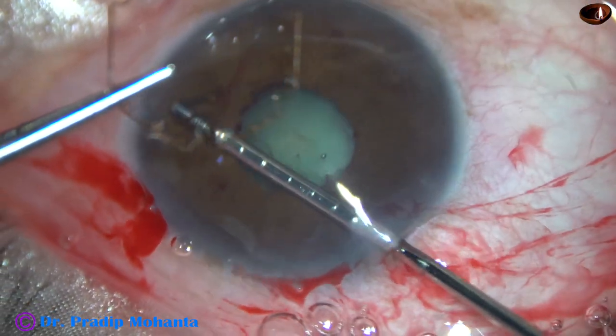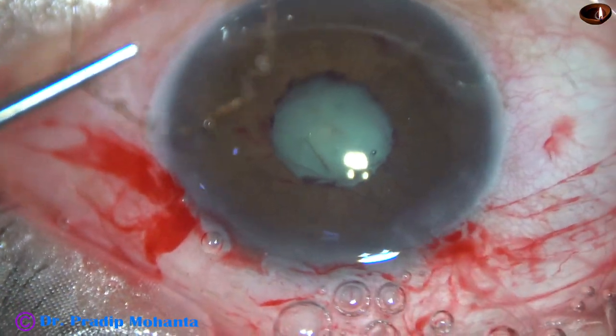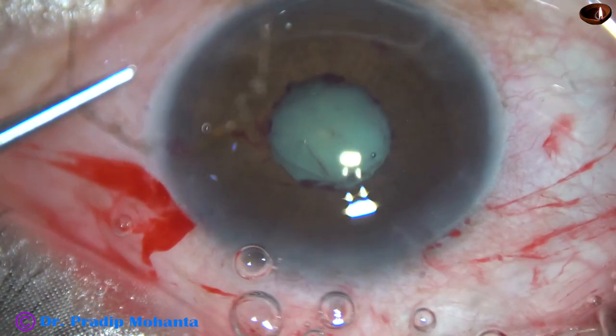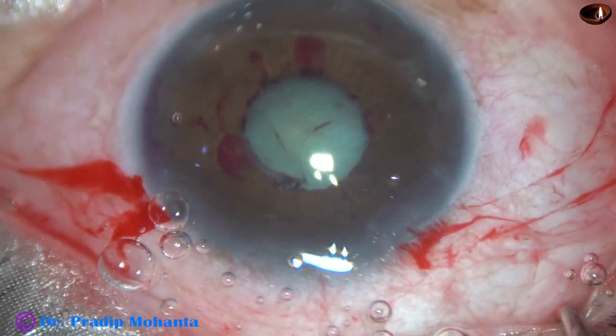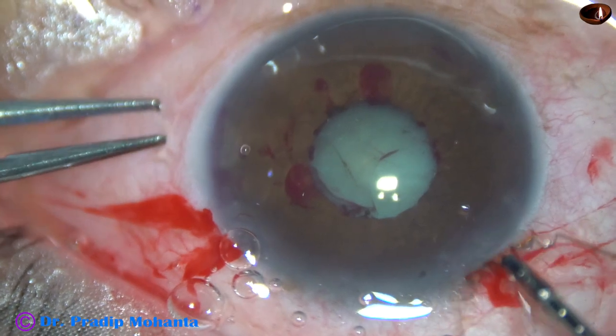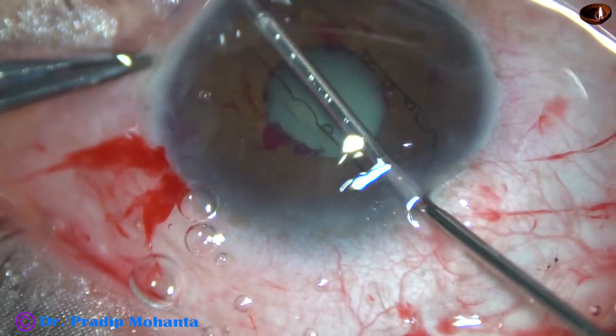And now I am going to remove this fibrous band which was around the pupillary margin. When you remove this fibrous band from the pupillary margin, there is some amount of punctate bleeding.